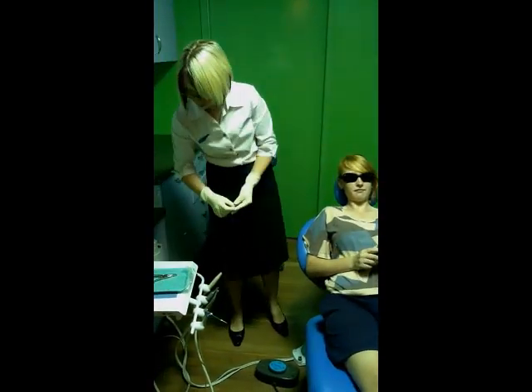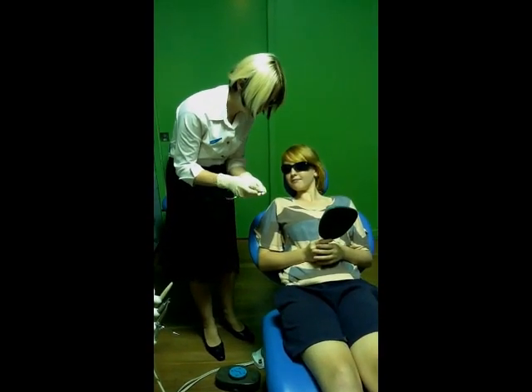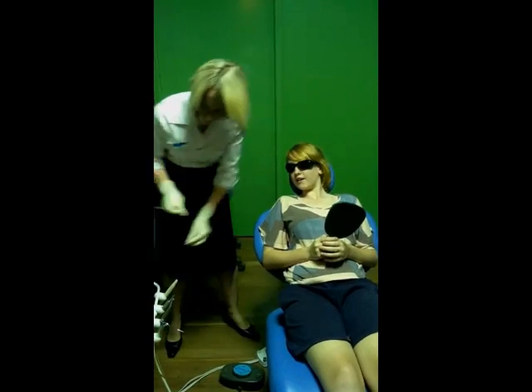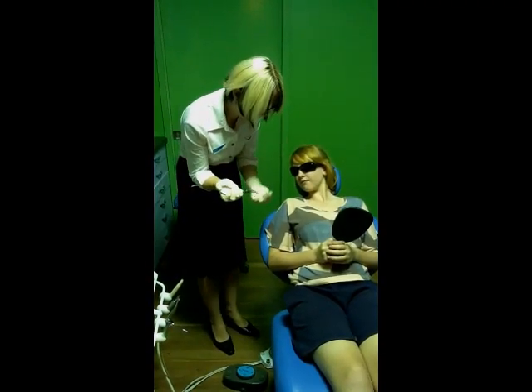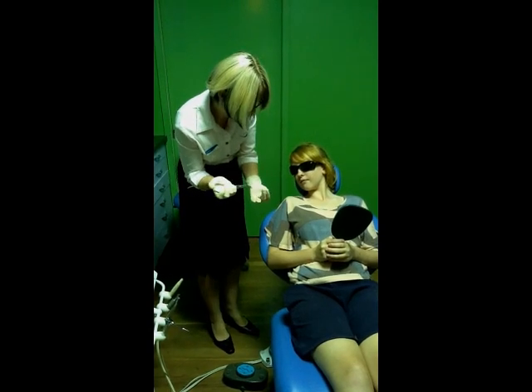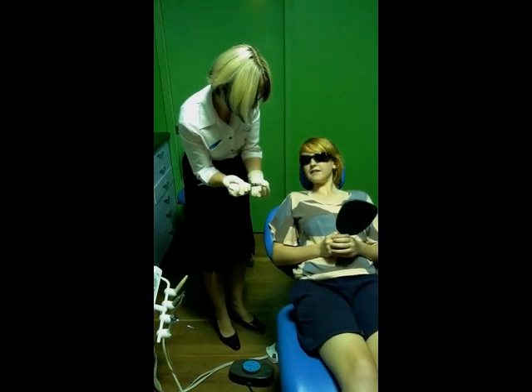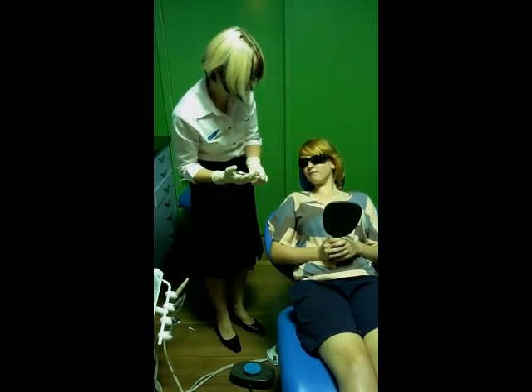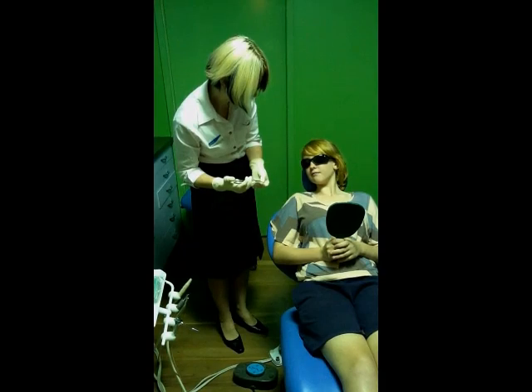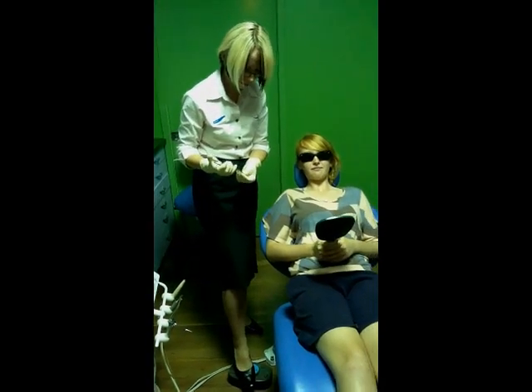Now what we're going to do, I'll just show you these little spaces we were talking about. Basically it's these little blue rings here. We only need them for your back teeth. So I use these tweezers and I stretch them like that. And if you pretend that my two fingers are your back teeth, basically it slides in between like that. Now it will feel tight when they're first going in there. You will feel it. But it shouldn't hurt too much and it will settle down eventually. Just going to pop your chair up a little bit.